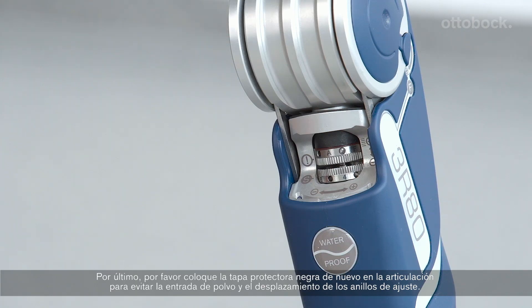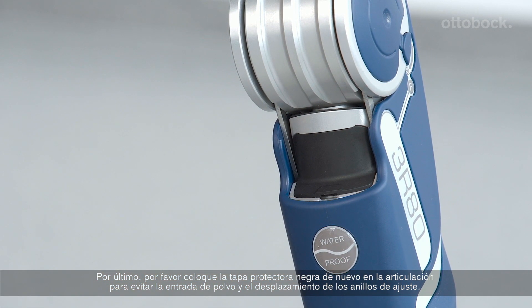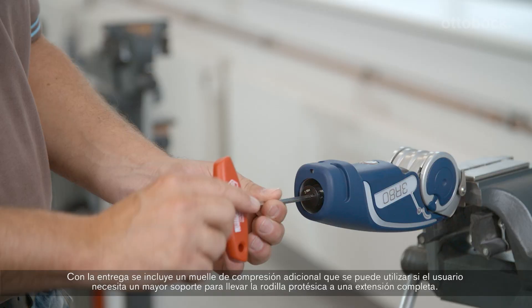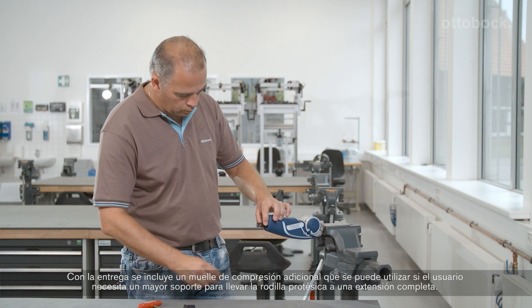Replace the back cap on the knee joint to prevent dust from entering the joint and the adjustment rings from slipping. There is an additional compression spring included with delivery that can be used if the user needs more support in order to bring the prosthetic knee joint to full extension.